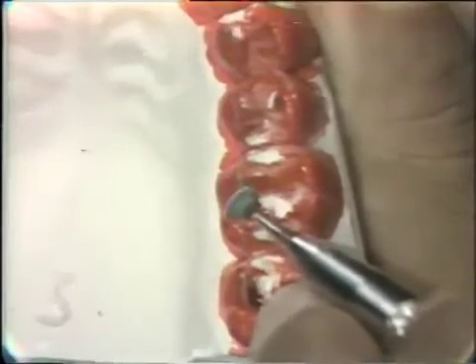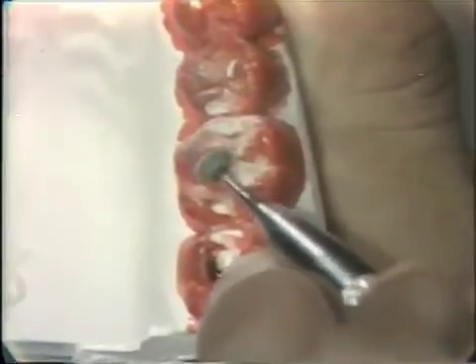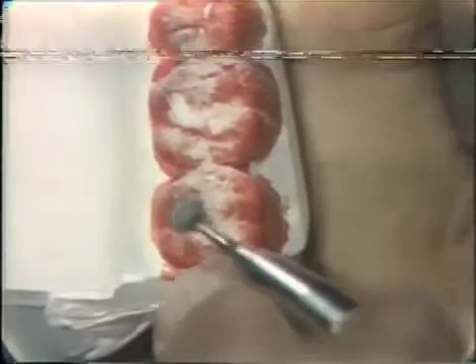In this area of this pronounced oblique ridge, it would probably not affect the centric contacts of this tooth. So in the oblique direction — not completely obliterating the cusp, but going in the direction of the mark — we will reduce some of this guidance.